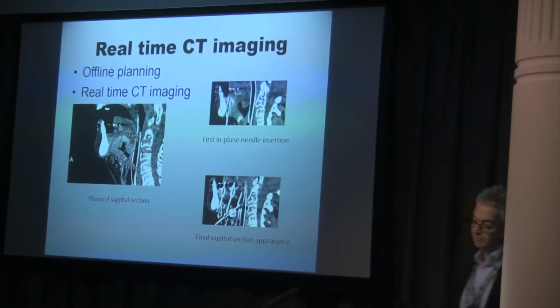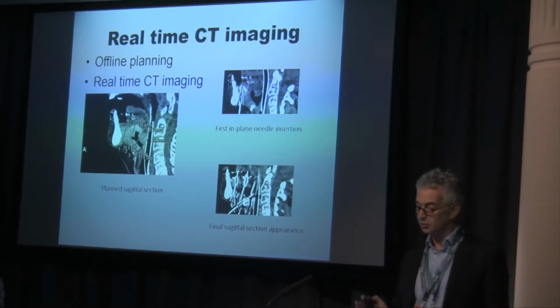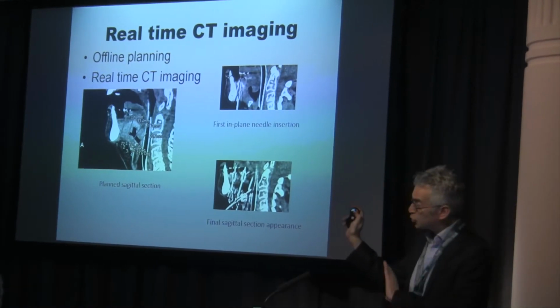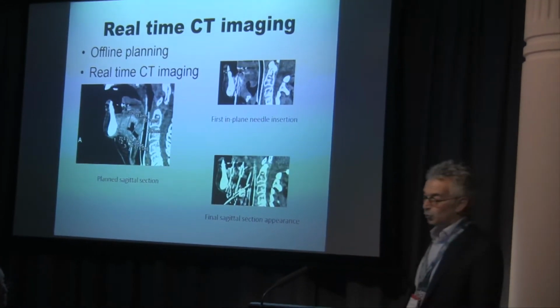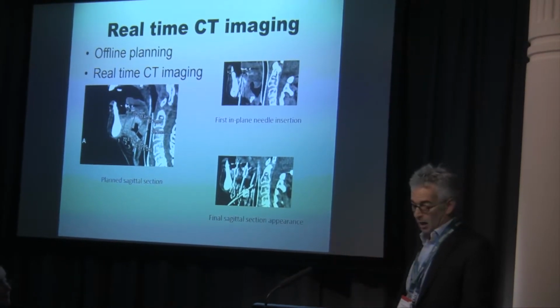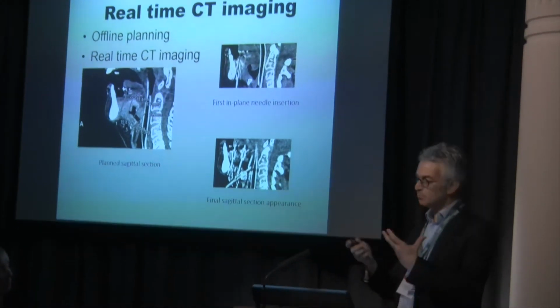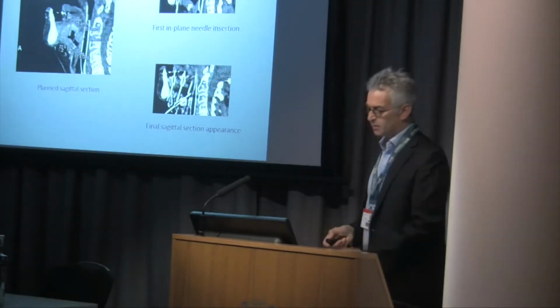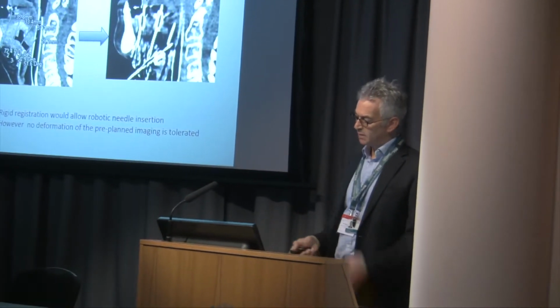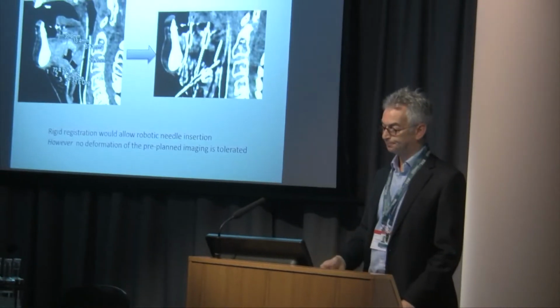So CT is fabulous because you can really work at it. You can measure things and you can plan your attack if you want to treat large volumes. It would be wonderful if you could do it robotically with templates, though that's very difficult because again people tend to move, but you can do it in real time here. Clearly the plan would be to have a plastic template or whatever, and it's all pre-planned.